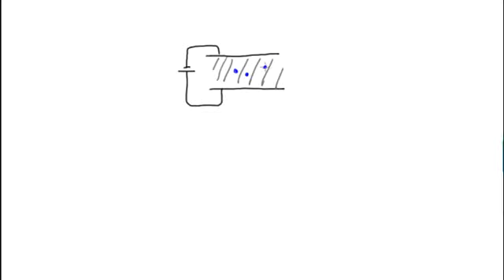And then inside the chamber are going to be charges. These are electrons that are going to be made in ionization events, as the electrons and photons come through. So they're attracted to the plate because of the voltage gradient. There's a force on these electrons, makes them flow towards the anode. And then that charge is collected on the anode. And if you leave the beam on for a certain amount of time, you collect a certain amount of charge. And that charge is going to be written with the symbol Q. That's a standard nomenclature. Remember that the units of that are coulombs, C, or typically nanocoulombs would be measured in a therapy beam. So that's the typical range.